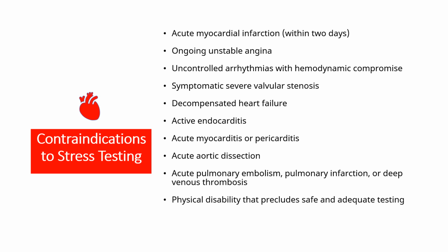So when should we not do the stress test? Stress test does put the patient at risk of having symptoms, heart attack, and even death. The list of contraindications for the stress test are on the slide. These can be ascertained by simple history taking, record review, and a basic physical examination. Please go over this list at your own pace, and this should be available to you in the stress testing lab.